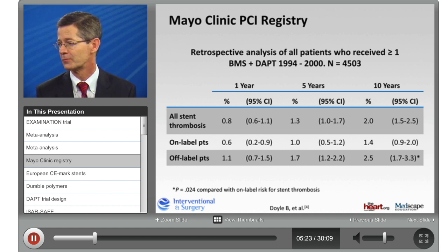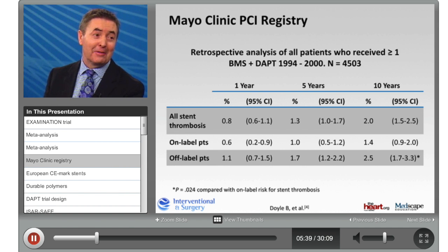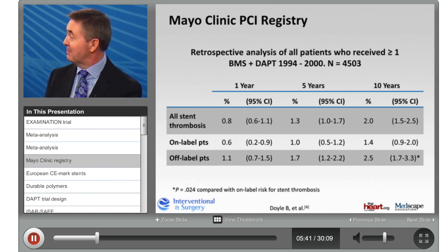So let me ask this. In terms of bioabsorbable polymer-coated stents, in the U.S. we don't have any, but certainly the rest of the world does. I wonder, just comment, what's the uptake been in your practices and what you see? Well, probably Sigmund is better to speak to that because many of these are actually CE marked and being used in Europe.